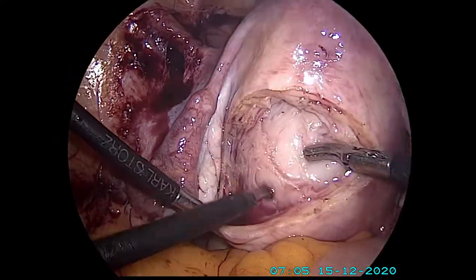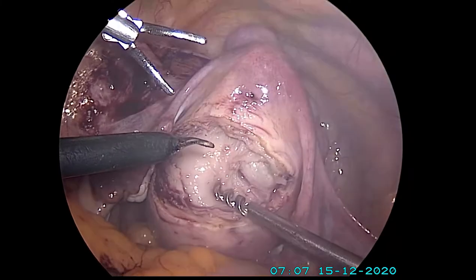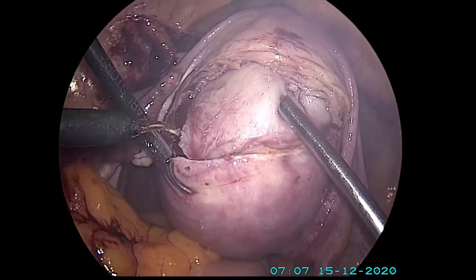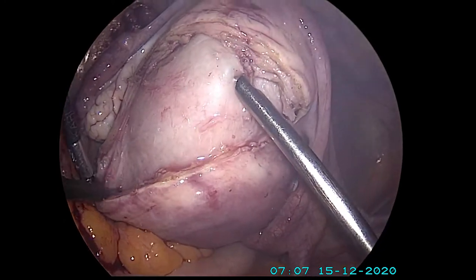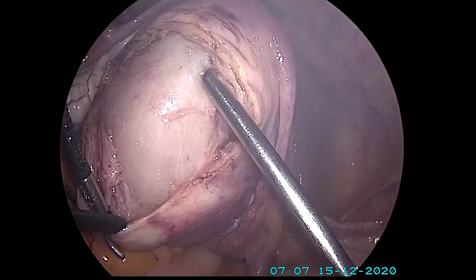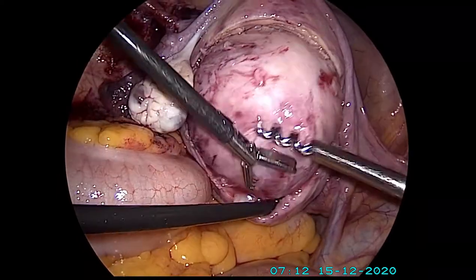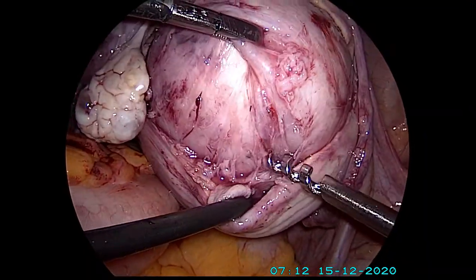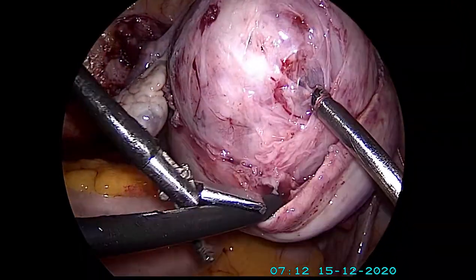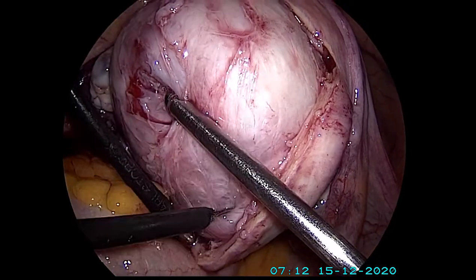What is coming out in between is that fibroid, and it has a big thick capsule around it. My right hand is now putting in what is called a myoma screw, or a fibroid screw. It's a very simple technique — it looks very simple — of pulling and peeling off. It's almost like peeling off an orange. We apply traction with one hand and with the other hand we peel off the outer capsule, and then the fibroid from in between comes out. It looks very simple but takes years and years of training to actually get there — almost like watching someone play a video game and feeling it's very simple until you play it yourself.